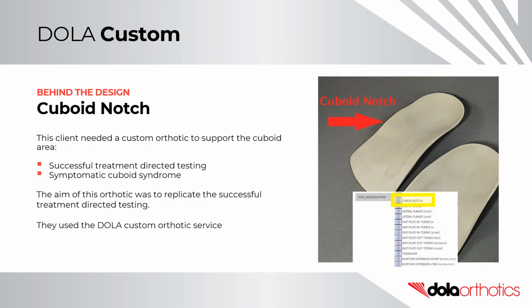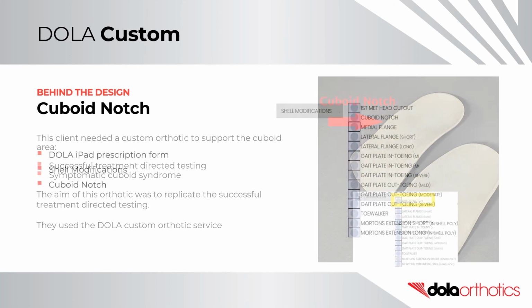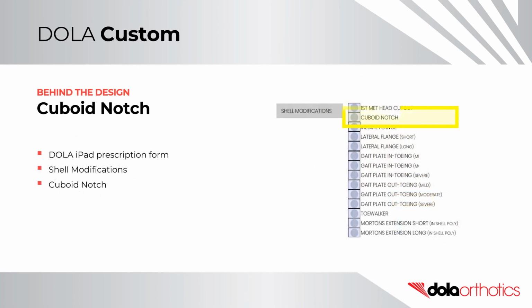Behind the design, Cuboid Notch. This client needed a custom orthotic to support the cuboid area. They completed successful treatment-directed testing of a cuboid pad. The patient was symptomatic for cuboid syndrome. The aim of this orthotic was to replicate the successful treatment-directed testing. They used the DOLA Custom orthotic service. They selected the Cuboid Notch from the shell modification section on the DOLA iPad prescription form.